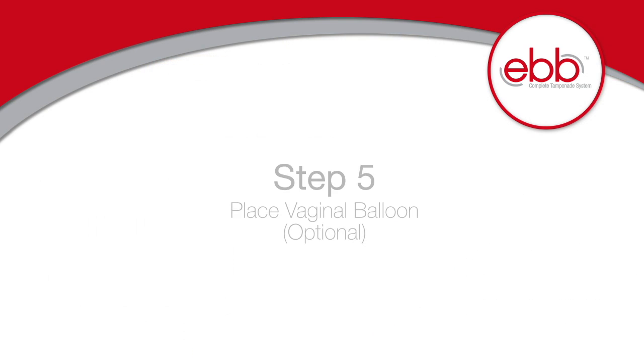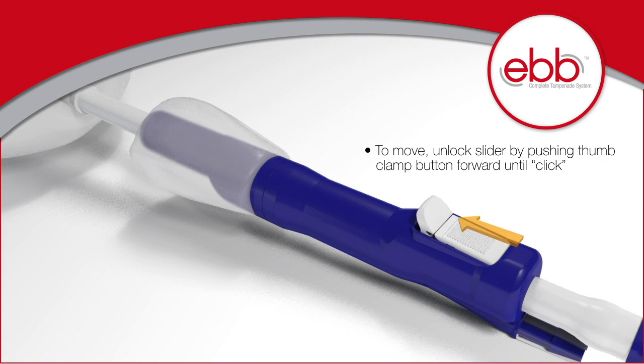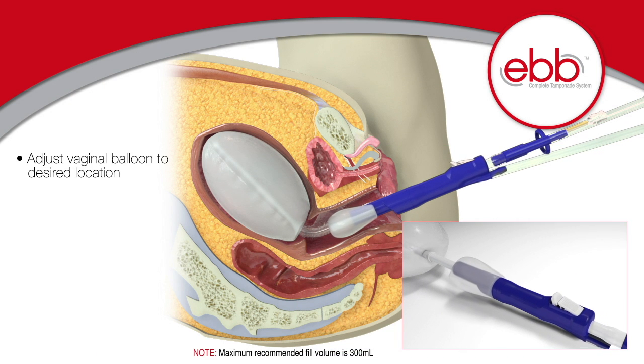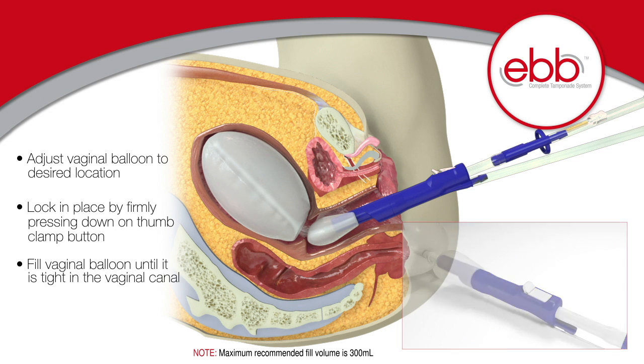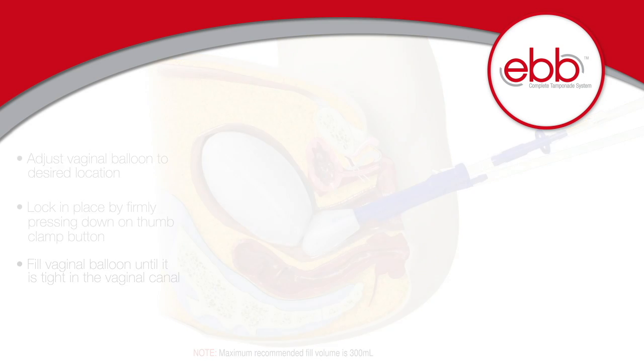Step 5: Place the vaginal balloon. Although optional, the vaginal balloon helps anchor the uterine balloon in place. To position it, unlock the slider by pushing the thumb clamp forward until you hear an audible click — the balloon will now move freely along the catheter to your desired location. Lock in place by firmly pressing down on the clamp. Fill the vaginal balloon until it is tight in the vaginal canal, reducing the likelihood of balloon expulsion.